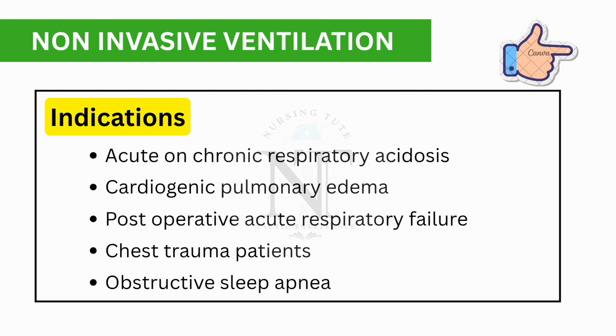And chest trauma patients. Patients with chest trauma are already very stressed, and mechanical ventilation will lead to more stress, and this will increase the risks associated with ventilation. So in order to reduce the risks, we can go with NIV.